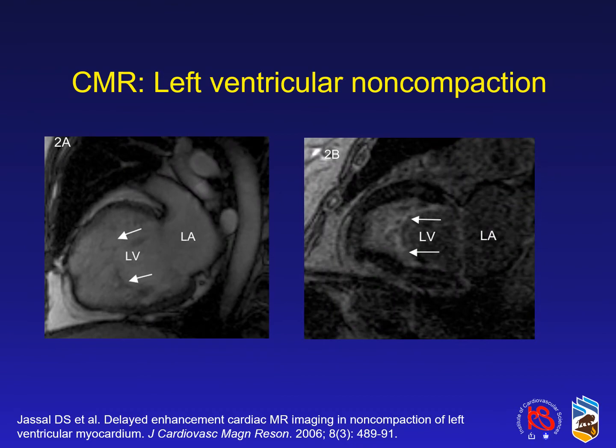As described earlier with respect to the role of gadolinium administration in cardiac MRI for tissue characterization, in individuals with LV non-compaction, if there is enhancement of the LV trabeculations, this can serve as a substrate for increased arrhythmogenesis in this patient population.